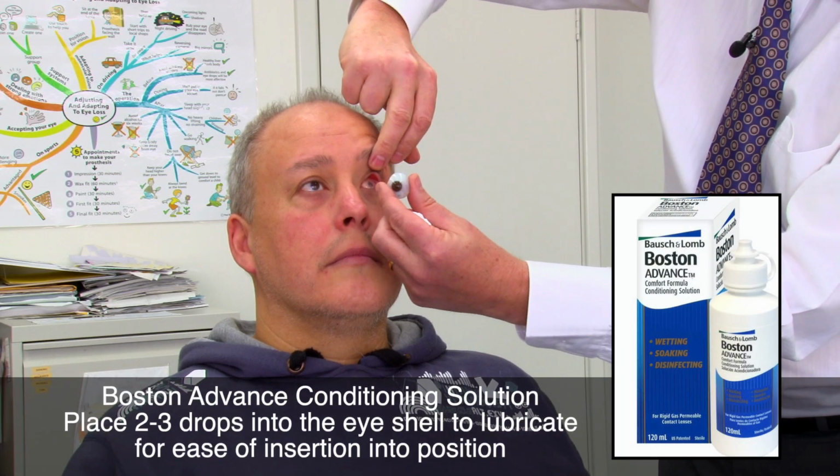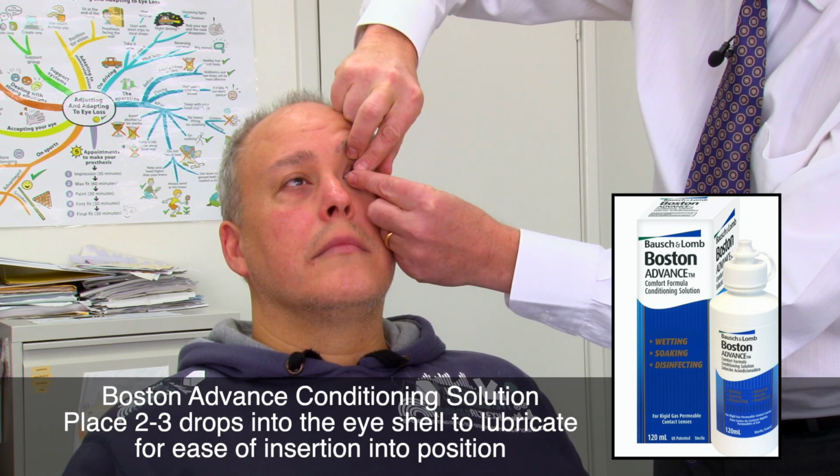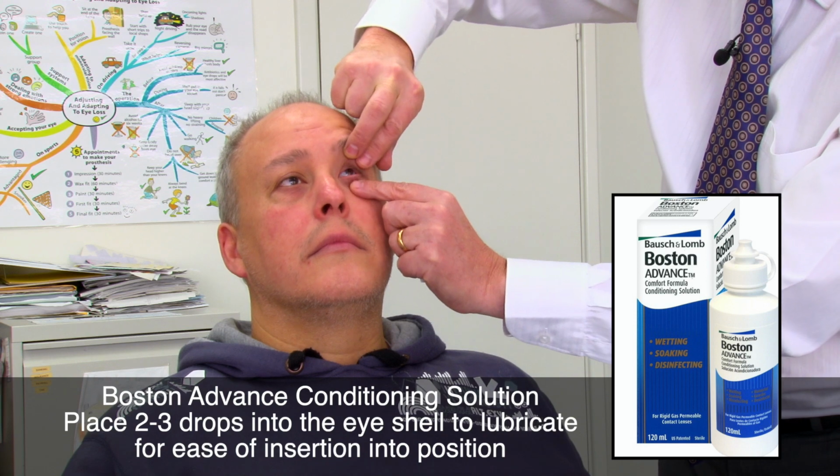To put the artificial eye back in, you want to lift up the eyelid. You want to make a nice gap under the eyelid. You push the artificial eye up underneath the eyelid, and then you pull the bottom lid down, and it will just sit into place. It's very easy once you know how to do it.